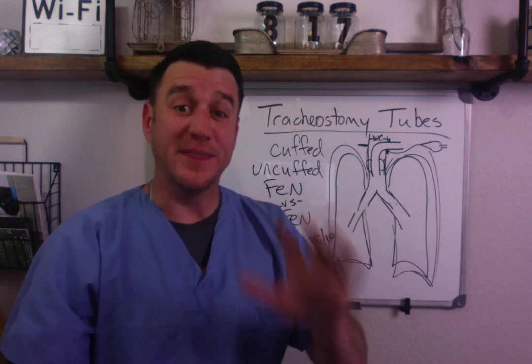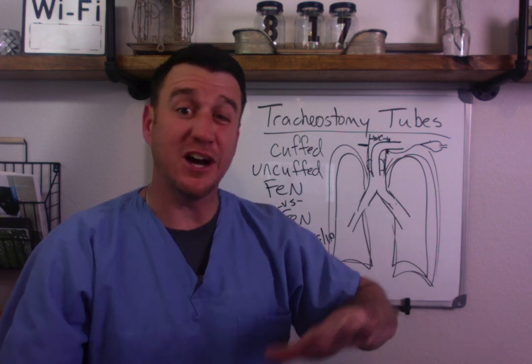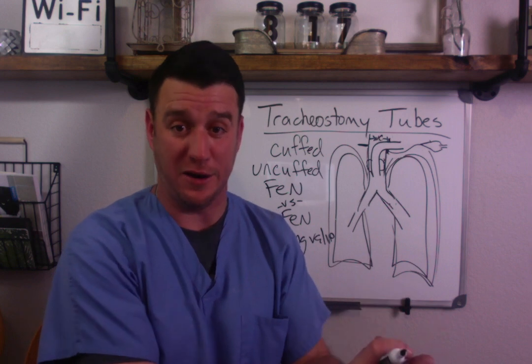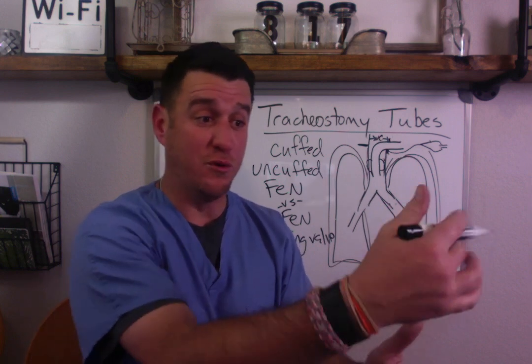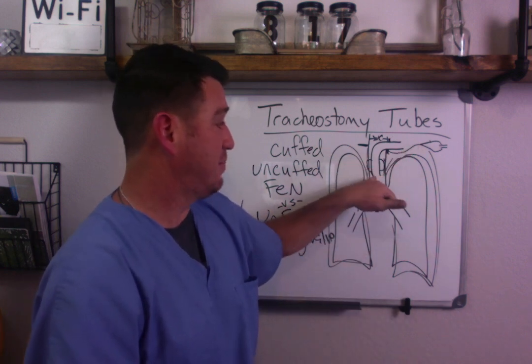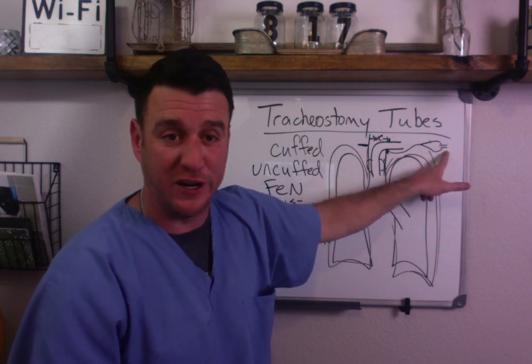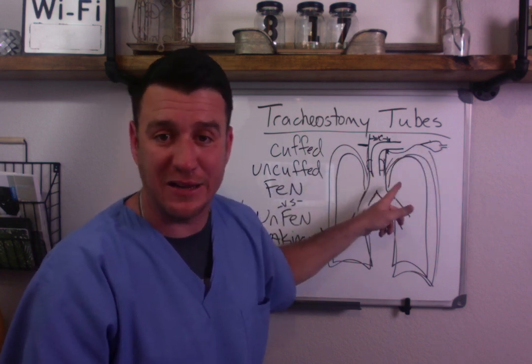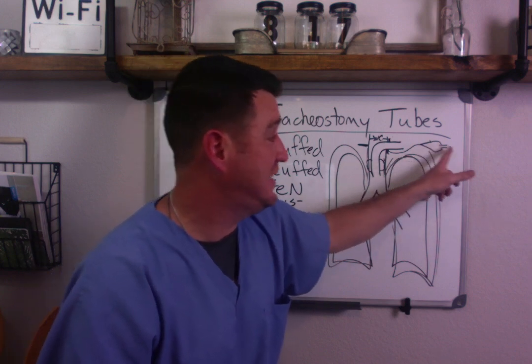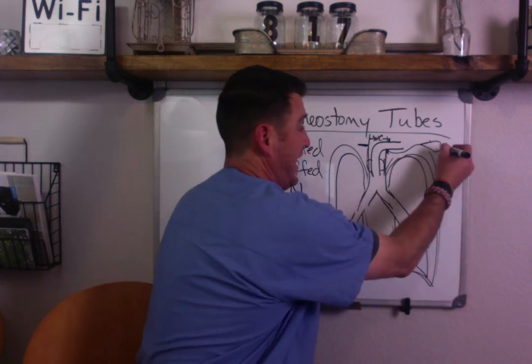Okay, this trach functions differently than all other trach tubes. Because with other trach tubes, the Shileys, you have to inflate the cuff, and then if you want to take it down, you have to deflate the cuff. The difference with the Bivona foam trach is that when this port is open to atmosphere, your cuff automatically inflates. To deflate it, you have to actively deflate the cuff, and then you have to close this off with a cap.